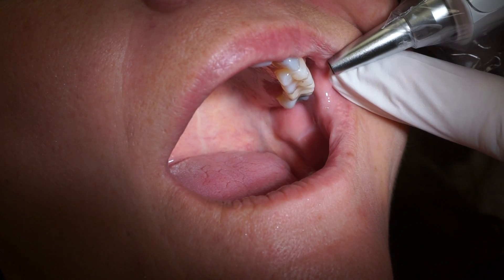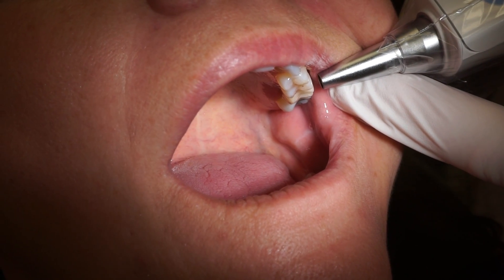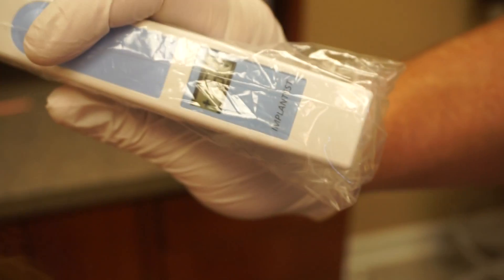Just for experiment's sake, I'm going to do it a little more occlusal in position. And 6.4 when we do it that way.